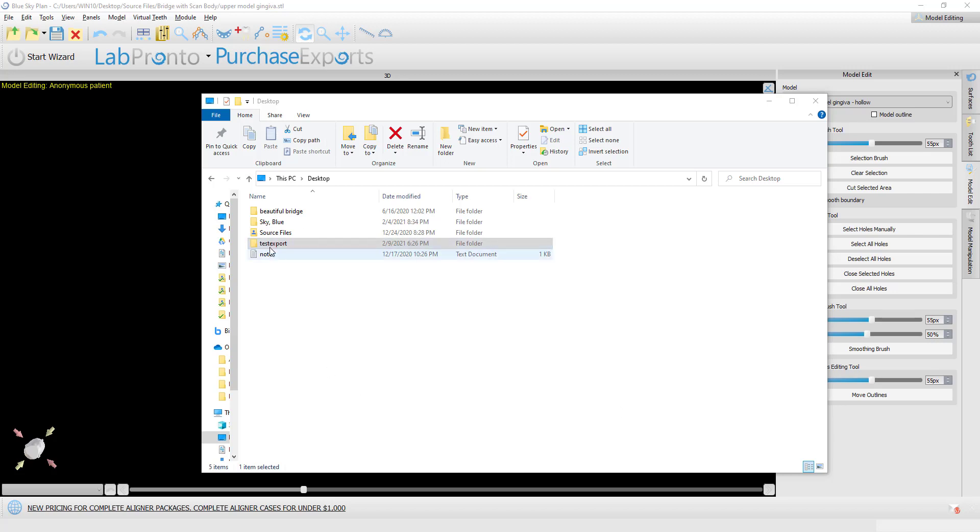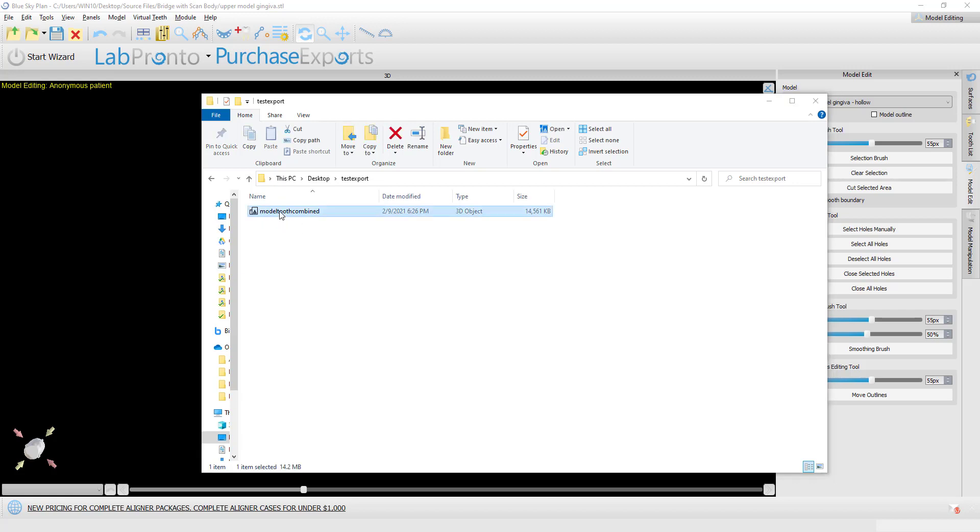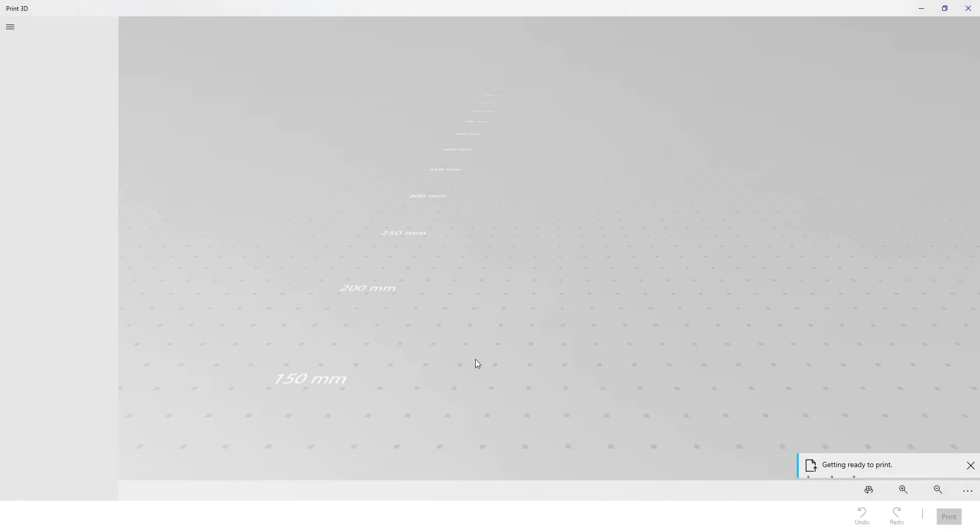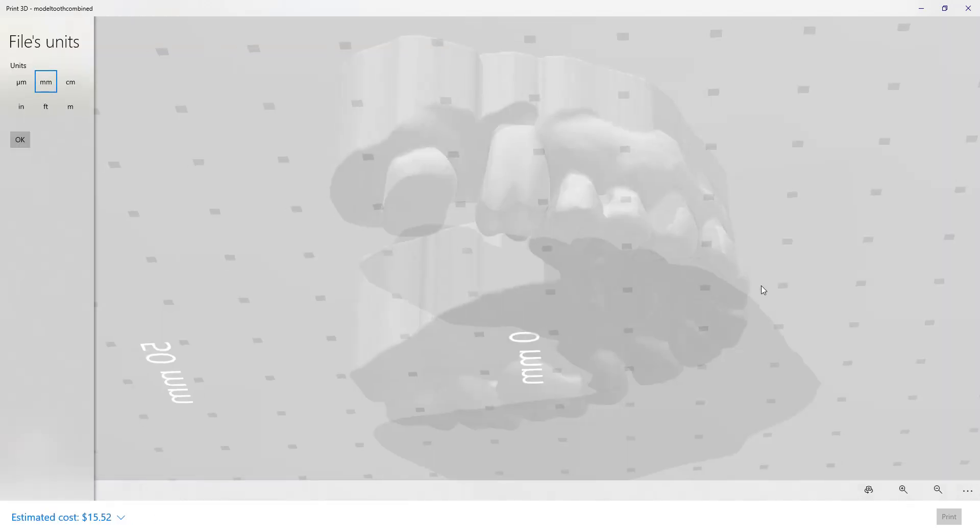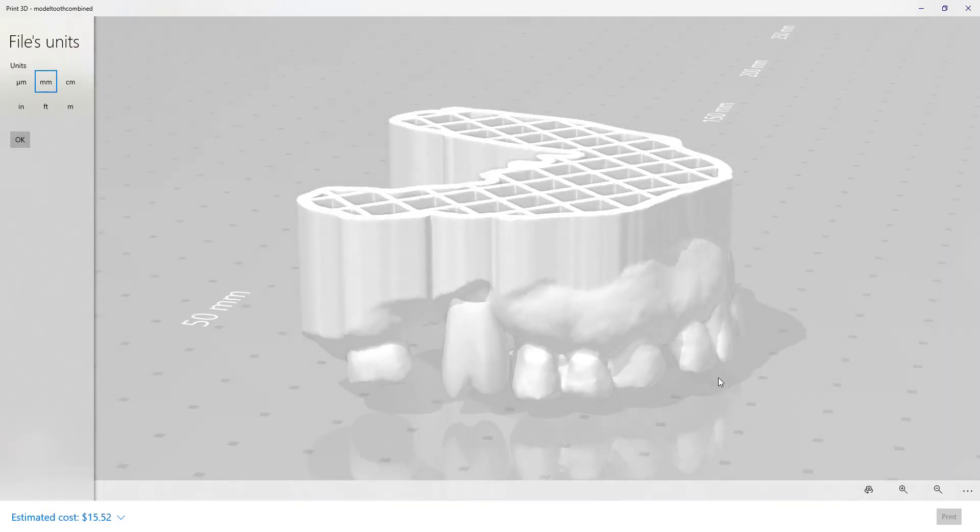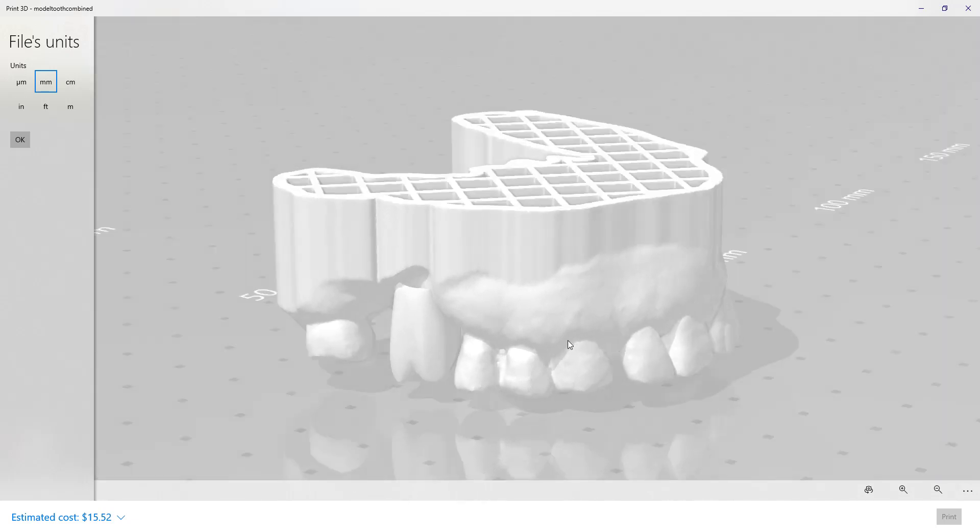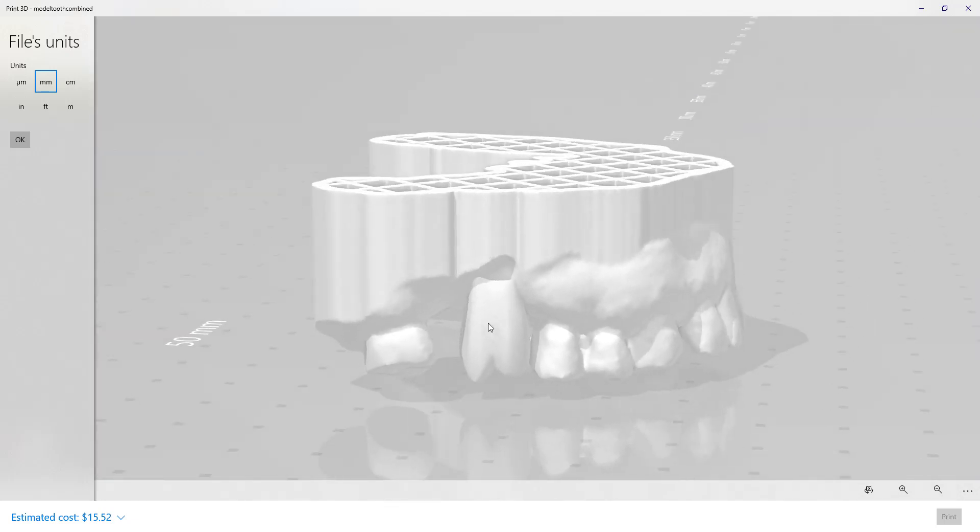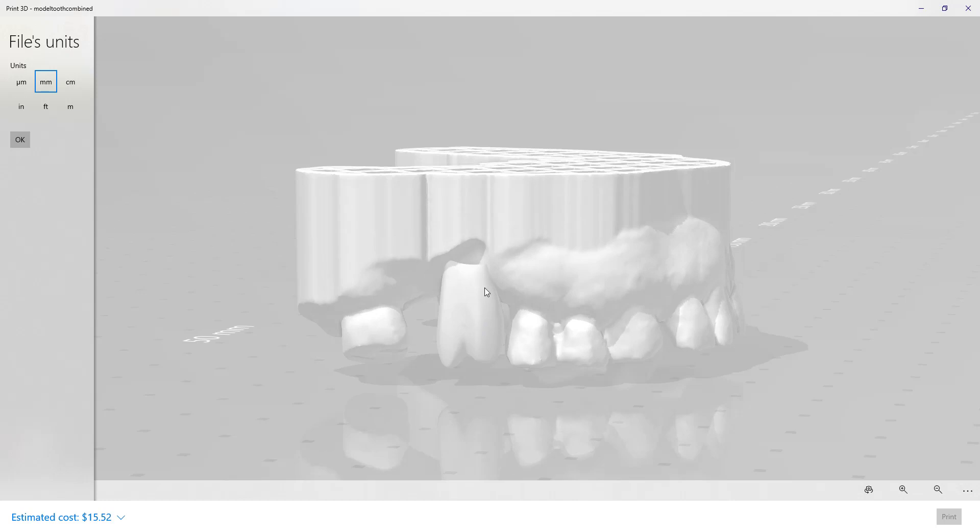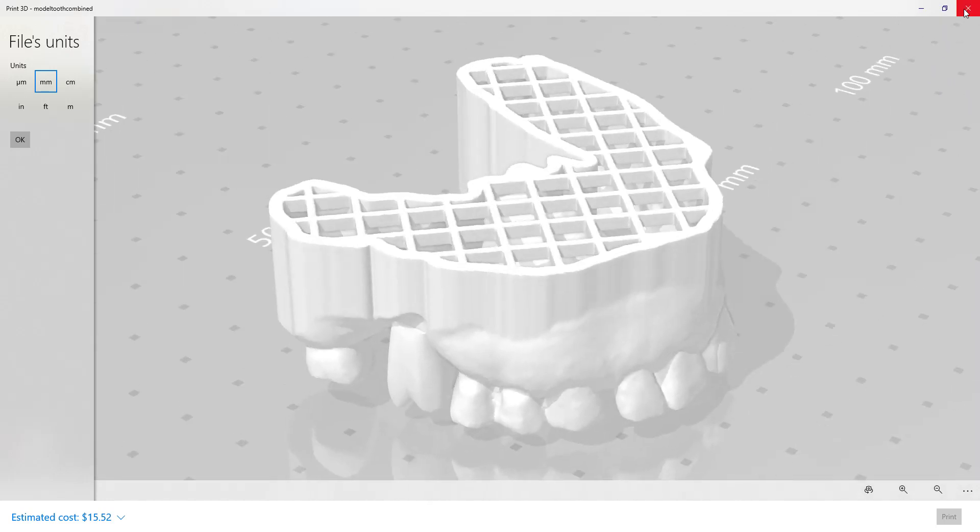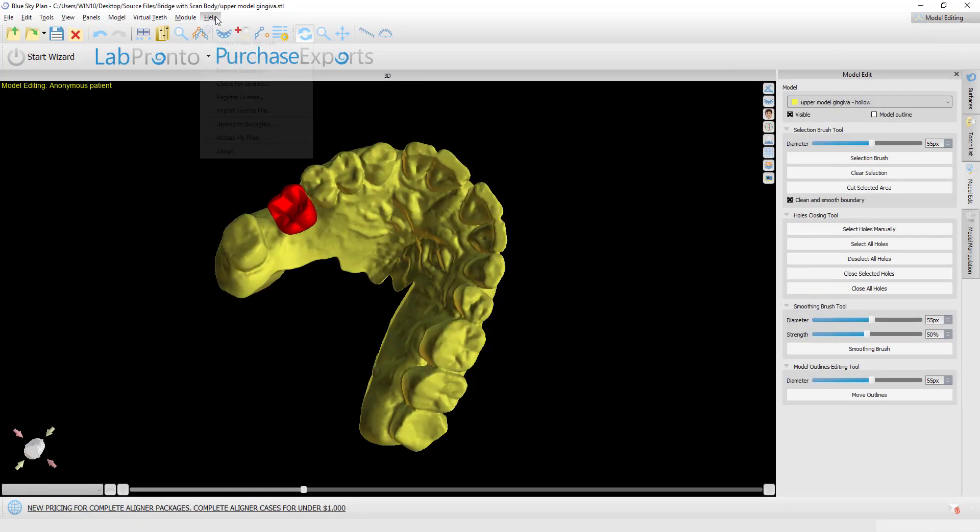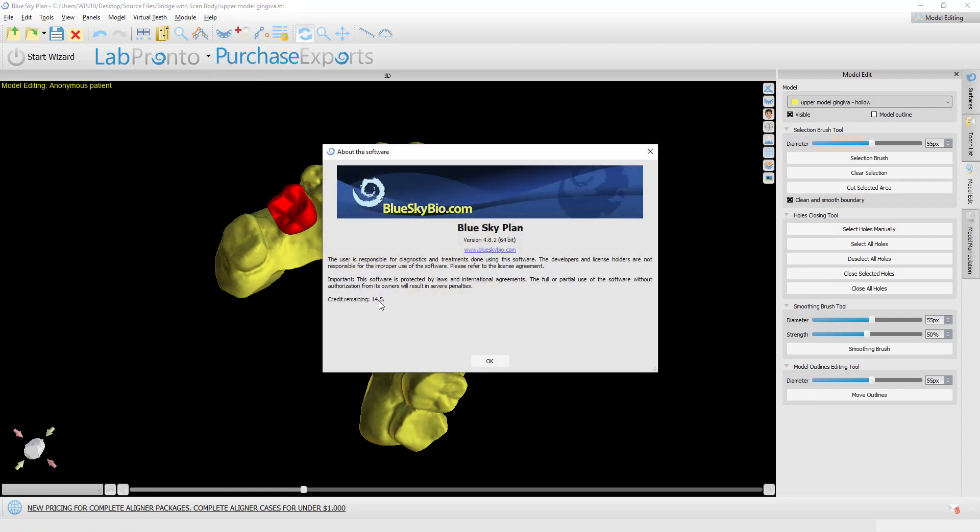I can now go to my desktop. I see the new folder that we made, test export. Double click. Here's the STL, here's the OBJ file, the object file that was created. Open it up. And here we have our hollow model with the tooth or with the crown combined. Obviously, you could spend more time with the design and making this look nicer. But here it is, we've accomplished what we wanted to accomplish. And if we check out our number of exports, we still have 14.5 exports. This entire process was done without using any export credits.